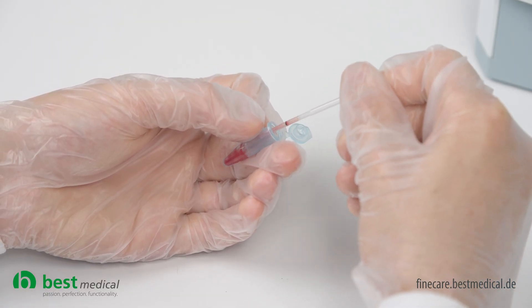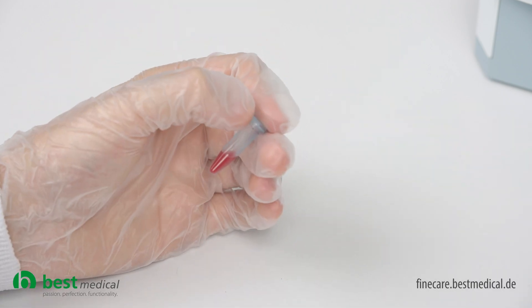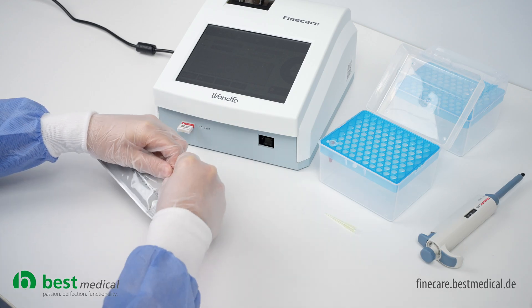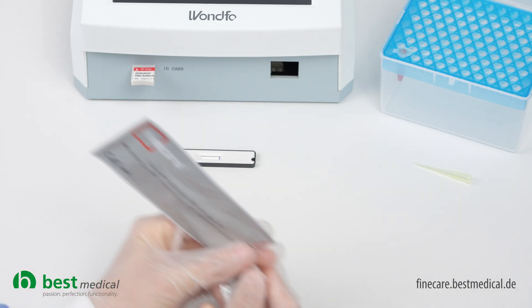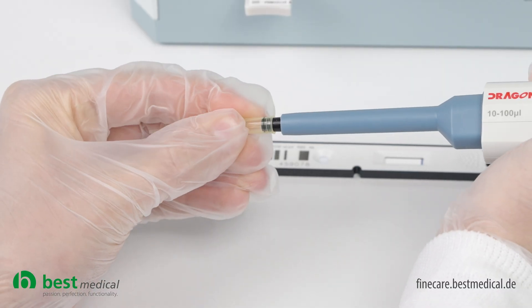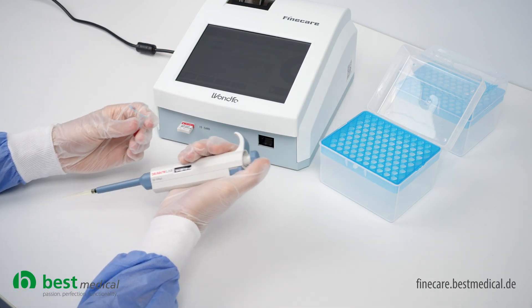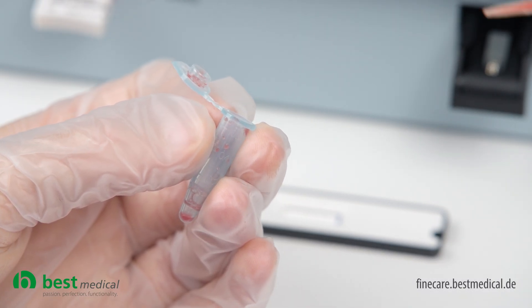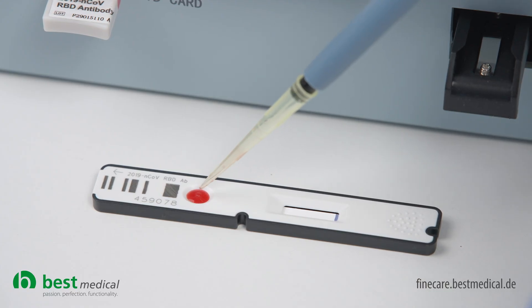Pour the sample into the pre-filled buffer vial and shake well. Open the packed test cassette and remove 75 microliters of liquid from the prepared sample using a pipette and a pipette tip. Pour the sample liquid into the oval opening of the test cassette.